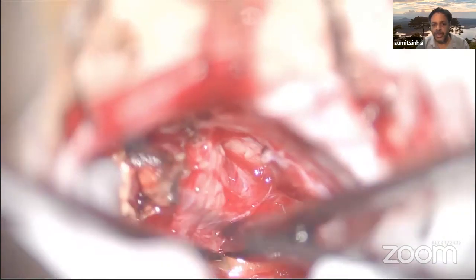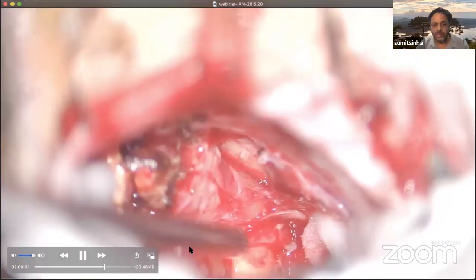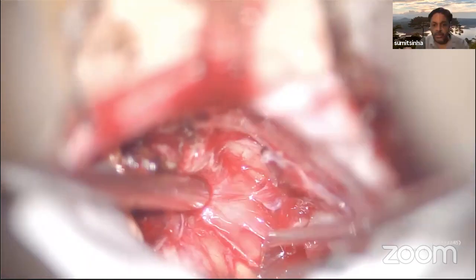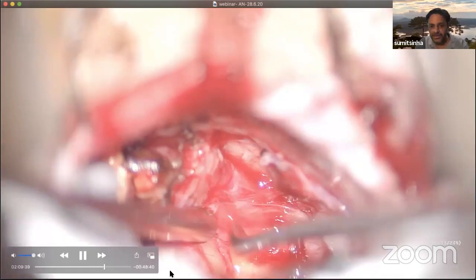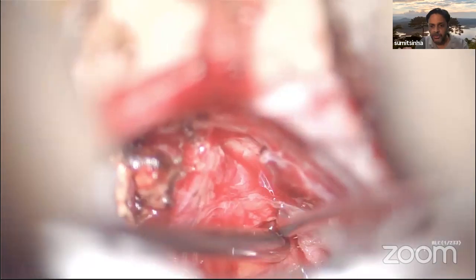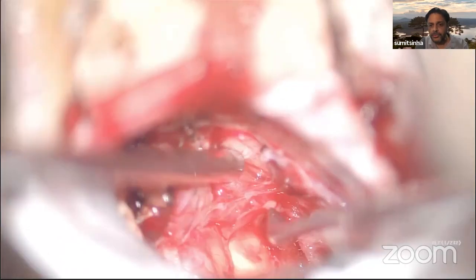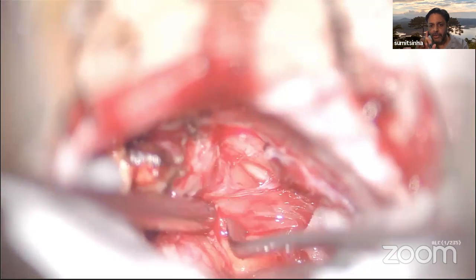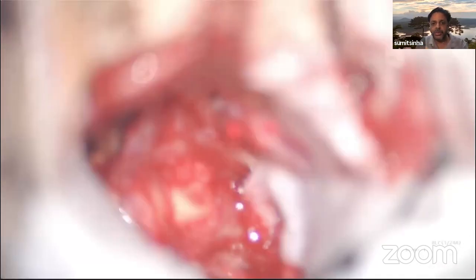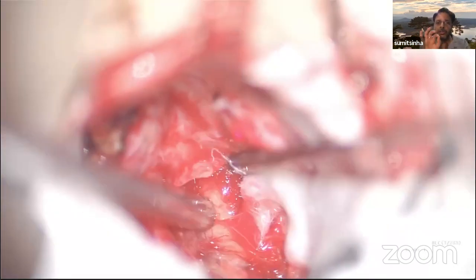Now you see this entire arachnoid. I want to show this in normal speed, because this is the most important step during the surgery for facial nerve preservation. I'm so sorry if it takes long, but this is a very important step. Everyone should see it. The residents, this is very useful to them as to how to dissect the facial nerve. Always use sharp dissection, use your sharp flat dissector, use your micro scissors. Do not approach with a bipolar near the facial nerve, come what may, and do not put the weight of a cotton patty on this facial nerve.